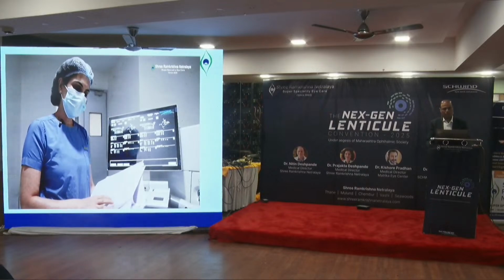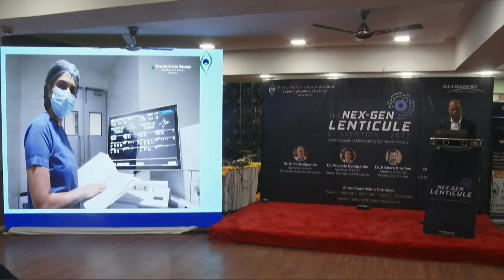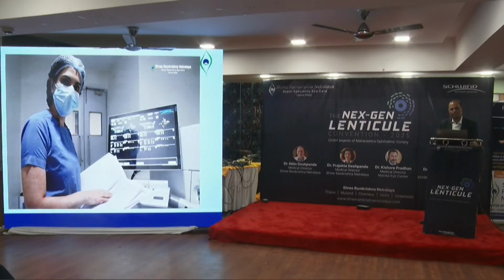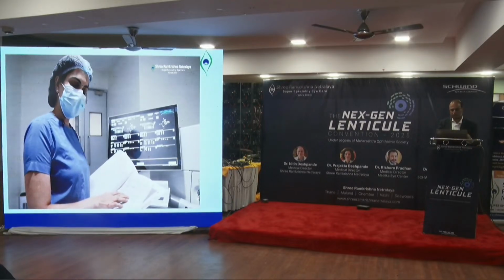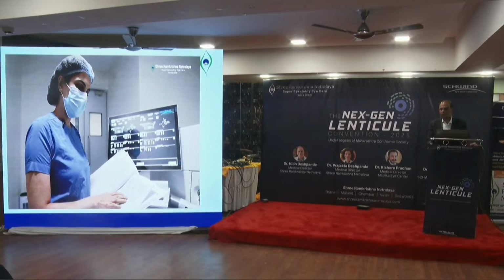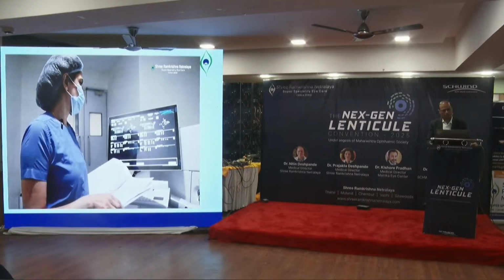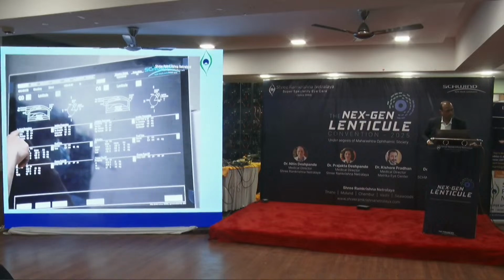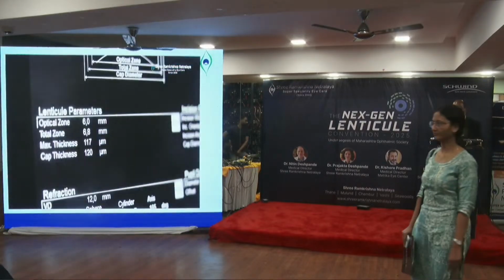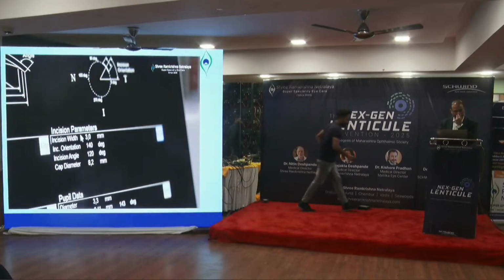So this is a 29-year-old male, and his refraction in the right eye is -7.25 with -1 cylinder at 165 axis. Vision is improving to 6/9, and in the left eye his refraction is -7.25 with -0.5 at 10-degree axis. Vision is improving to 6/6. So we have entered all the parameters. Optical zone in the right eye is 6 millimeters. Total zone is 6.8. Cap thickness is 120 and cap diameter is 8.2 millimeters.